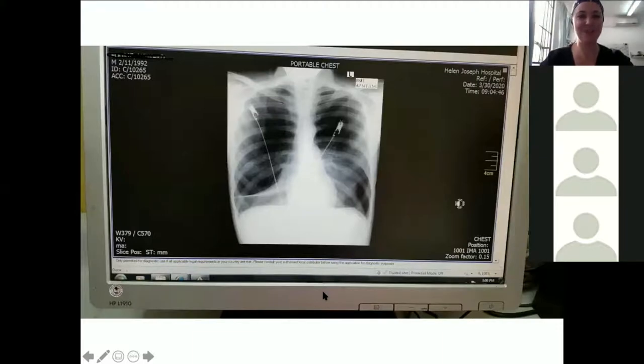Okay, let me talk you through what we've got here. I'm going to share with you what we've got, and then we'll talk through it bit by bit. So is the trachea central? Yep, I'm definitely happier that the trachea is central. Let me just close down the poll so I can bring up my picture. Okay, so trachea looks good. What can you see on those lung fields?